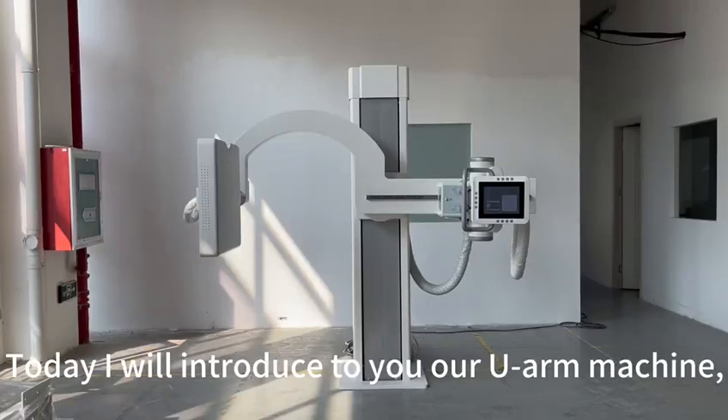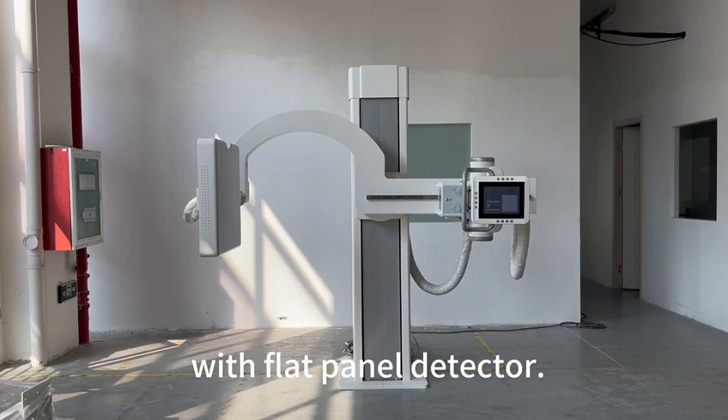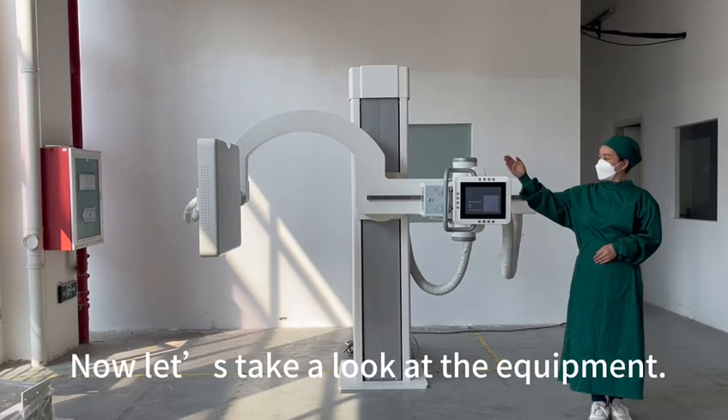Today I will introduce to you our U-Arm machine, the high-end digital U-Arm system with flat panel detector. Now let us take a look at the equipment.